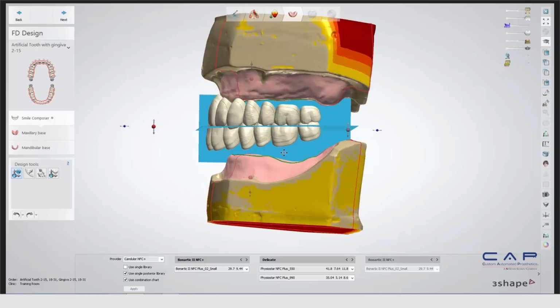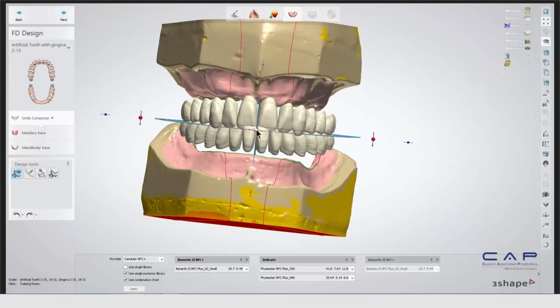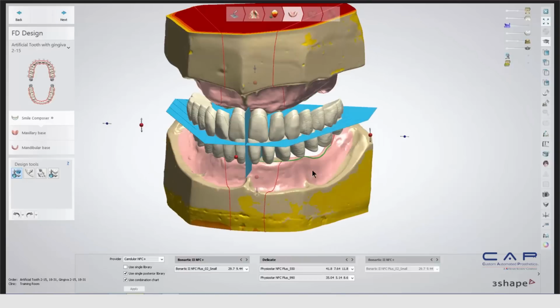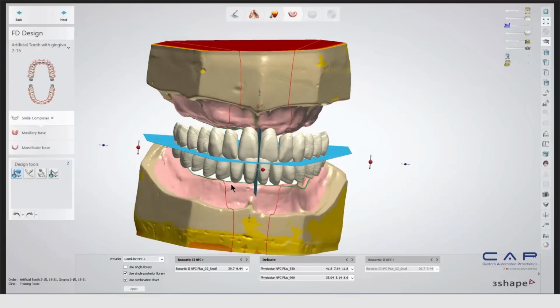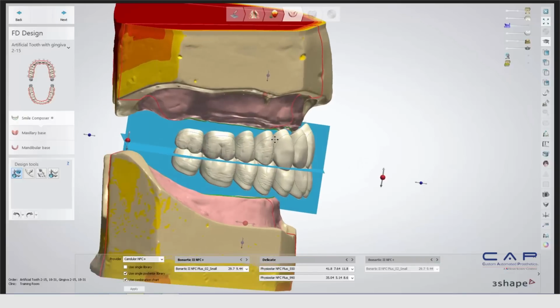Okay, once we have our setup, we'll take a look at it, and if you want to make any changes, like if we wanted to move the midlines over a little bit, you can do that to match up with the central papilla, or you can just leave it as is because of the setup. But you do have those characteristic points that map out these individual areas so you can help line up your canines or what have you, but usually they just tend to get in the way. So right now what we're going to do is set up our teeth and get them in a sort of form.